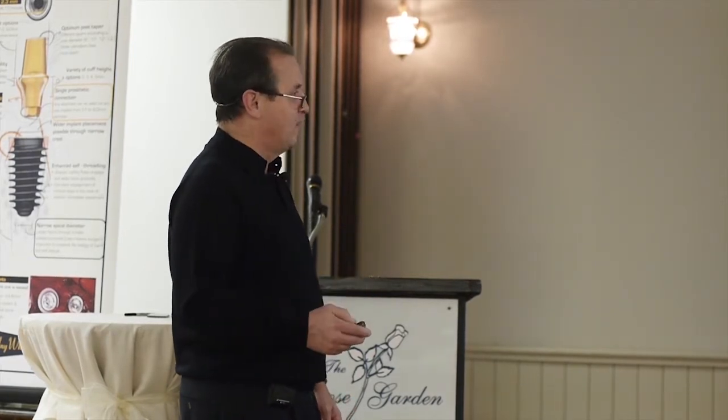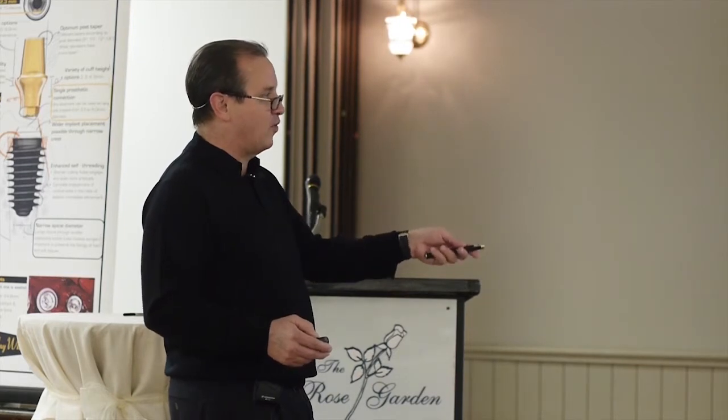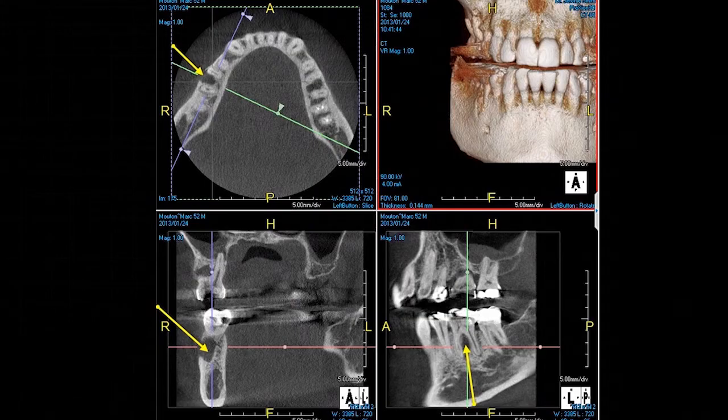And so before one of those teeth becomes a bridge abutment or gets a crown or something like that, I really want to find out if we've got something like that going on. Because when the tooth blows up, I don't want the endodontist to have to go drill a hole through the crown because we missed the diagnosis based on a periapical radiograph. Here we are down here, 19.